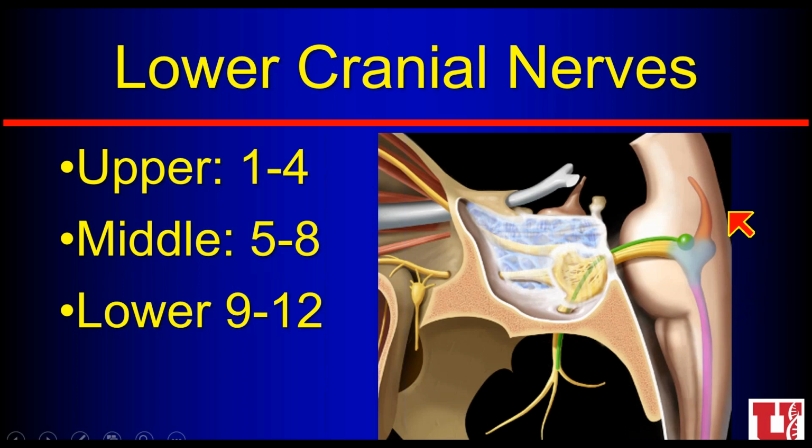For most of them, if we image from behind the pontomedullary junction through the face, we cover the area of interest. But we want to remember with the lower cranial nerves, we have the vagus nerve that may go down under the aortic arch. That's very important for us because if we have a vocal cord deficit or a vagal nerve problem, we need to image all the way down through the aortic arch in that area. So we want to remember that anatomy and remember the pathology imaging that happens to that anatomy.